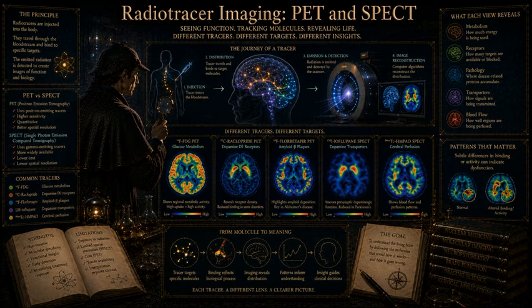But here is the major problem. The PET scanner, hovering over the head, cannot zoom in close enough to tell the difference between a car parked on the grass and a car parked in a VIP spot. It just sees the total aggregate amount of radioactivity in that region of the brain. It sees CT, the total concentration. Exactly right. CT is simply CND plus CS. The scanner only ever gives us one number for a voxel, CT over time. The entire multi-decade history of pharmacokinetic modeling is dedicated to using differential calculus and curve-fitting algorithms to untangle that single CT number and figure out exactly how many cars are specifically parked in those VIP spots.